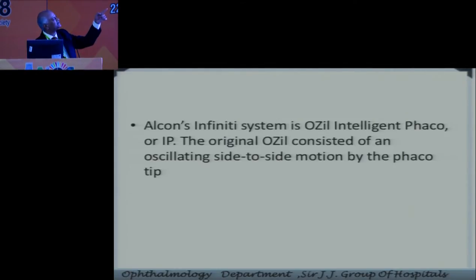Here it is, the intelligent Phaco, IP. The original OZil consists of an oscillating, side to side motion by a Phaco tip. So there are side to side motions in the oscillations of OZil. Now what happens in IP, that I am going to tell you.